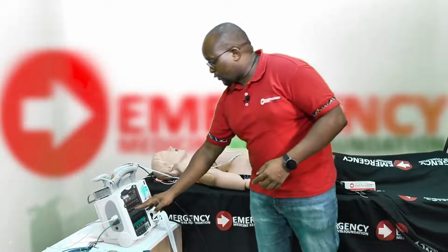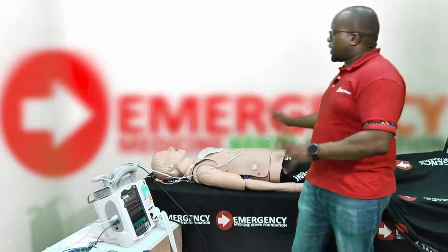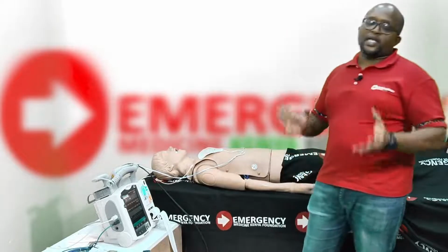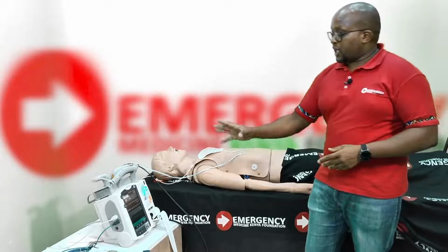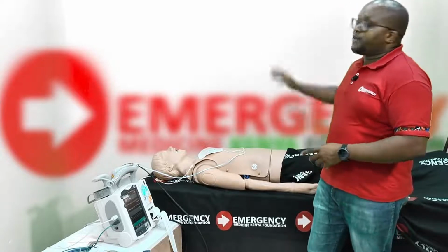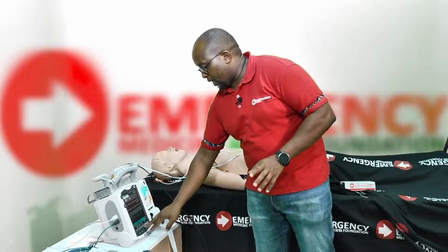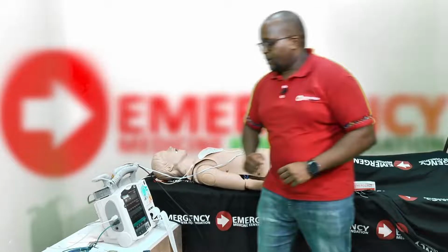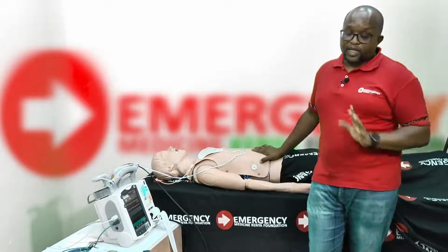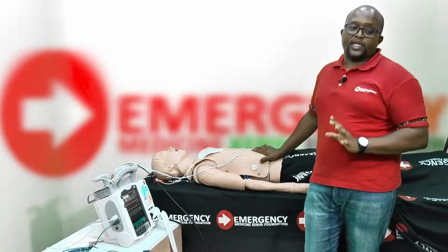And then again, still confirm that every spike is followed by a wide QRS complex. And I'm checking my blood pressure again, and my blood pressure has improved. And now I have physiological capture. Electrical capture, mechanical capture, physiological capture, and then now I'll go up by, remember, always go up by 10% as a safety margin, and there. Okay, so good, our patient is being paced. So this is establishing pacing in our patient.